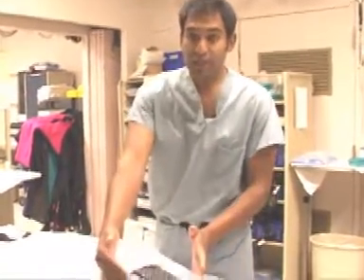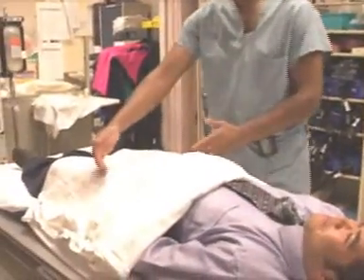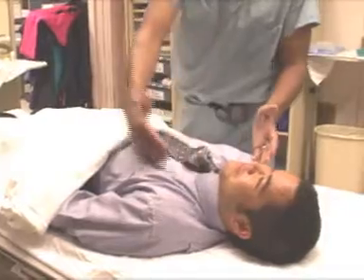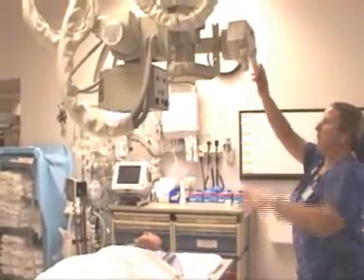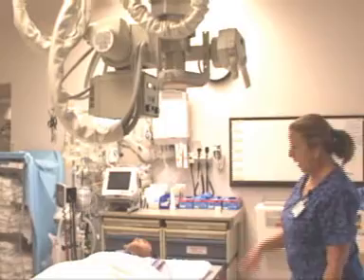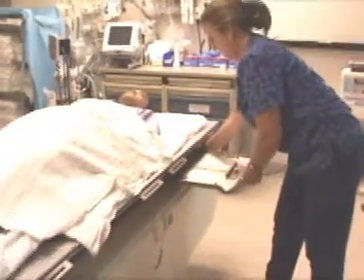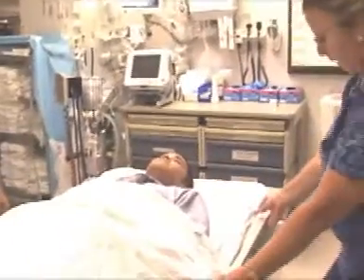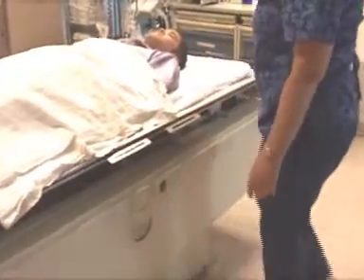All patients must have a chest x-ray, a pelvic x-ray, and a c-spine series. Our medical student, representing a trauma patient, is undergoing a standard AP supine chest film. Notice the patient must be flat during the chest film and, if possible, must inhale and hold his breath at maximum inhalation.